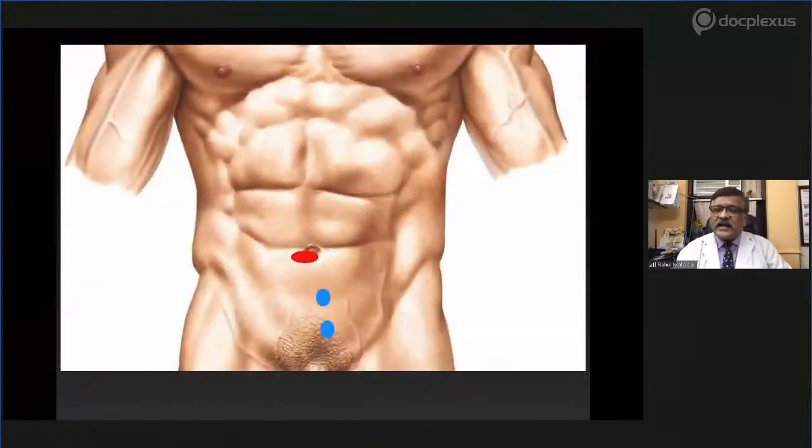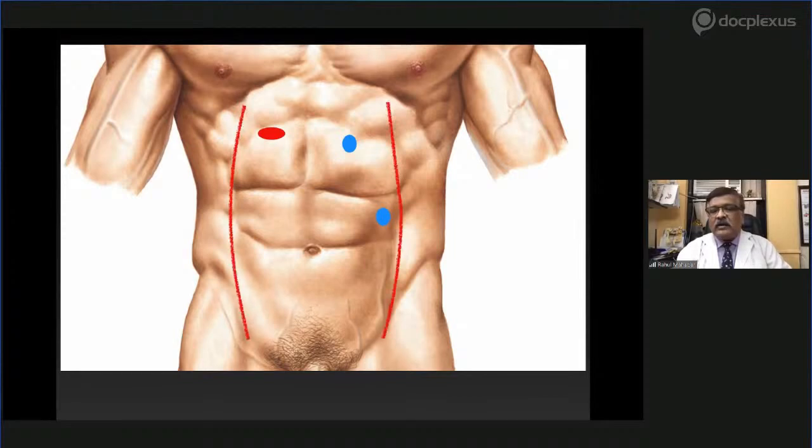What Jorge Daes did is, for inguinal hernia, instead of the standard port positions in the midline, he shifted these ports way laterally and above on the abdominal wall. Igor Belyansky pushed these ports way up into the upper abdomen, or the epigastrium, and from here he dissected the space till the lateral border of the rectus, and all the space is augmented with the help of the mesh, which is a common polypropylene mesh.